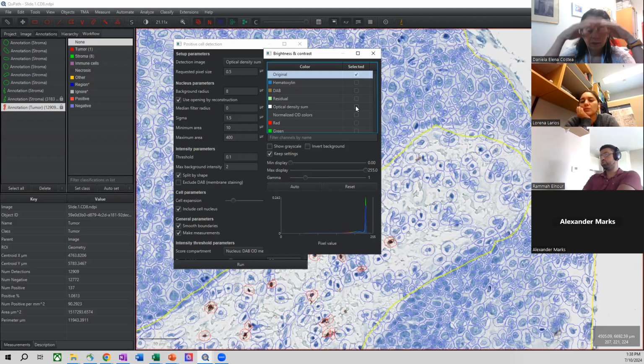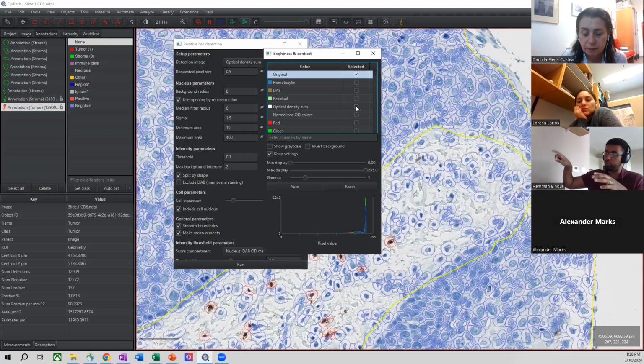But what are you probing or querying within ImageJ? Are you looking for the number of cells within the spheroid? No, it's just the area. See how they grow. The size. Yeah, area you could definitely do, because you see your image, right? Then you create an annotation for the spheroid, and within that annotation you get a whole bunch of parameters, including the area.